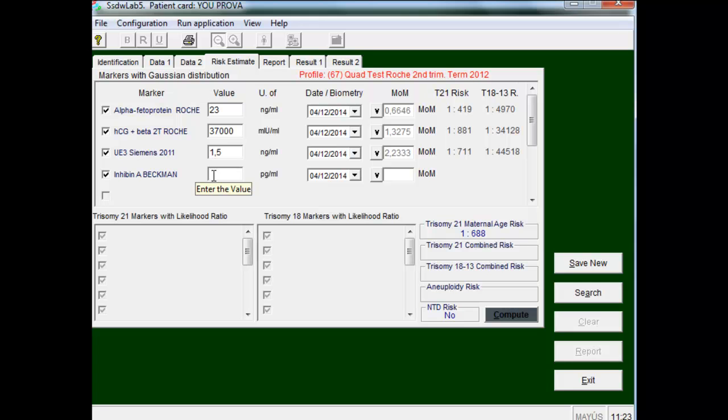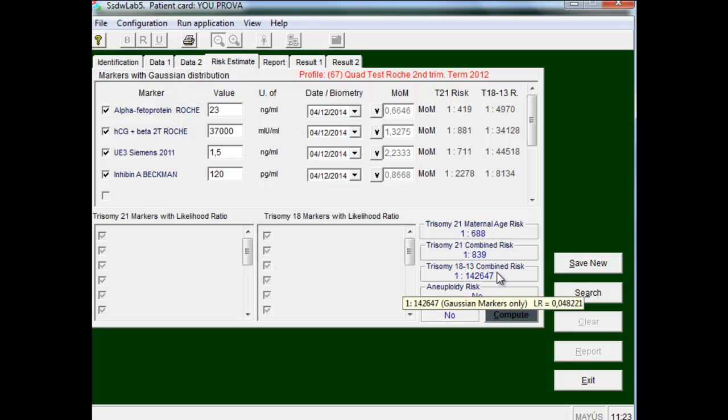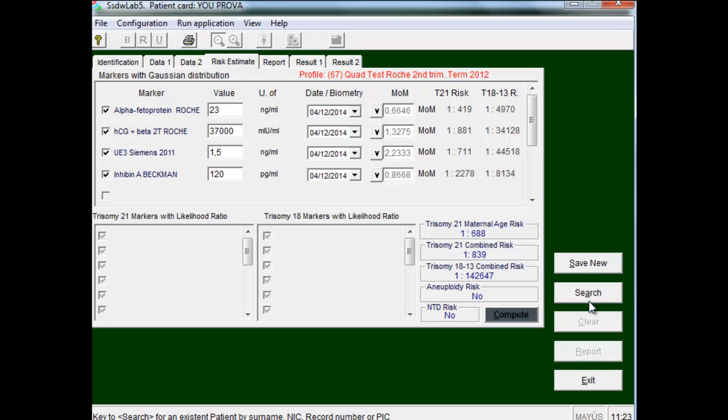When we have calculated the MOMs of all markers, it will be presented the patient's age risk, trisomy 21 risk, and trisomy 18 risk. If we want to see the report, we save the register.